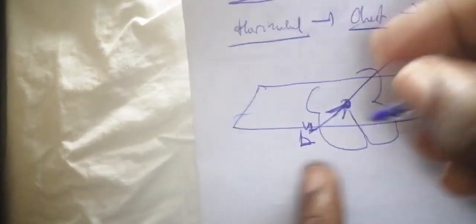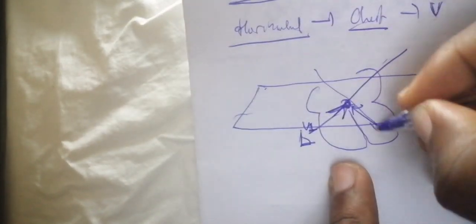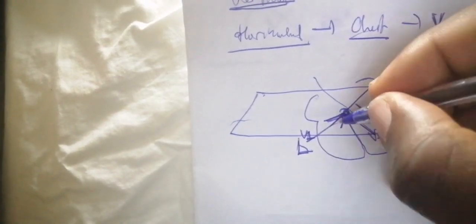Is it clear? It's going to visualize the heart moving in this direction on a horizontal plane. V2 is going to visualize the heart moving in this direction on the horizontal plane. V3 is going to visualize the heart moving in this direction on the horizontal plane as such.